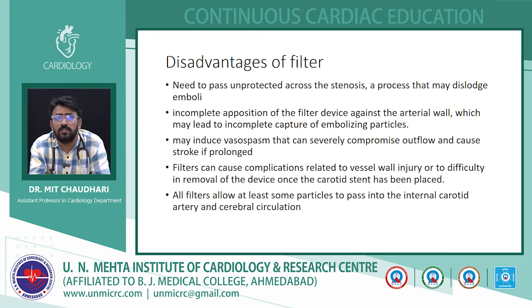So initially during the crossing, this process is unprotected. If some emboli occur at this time, then the cerebral circulation is not protected.